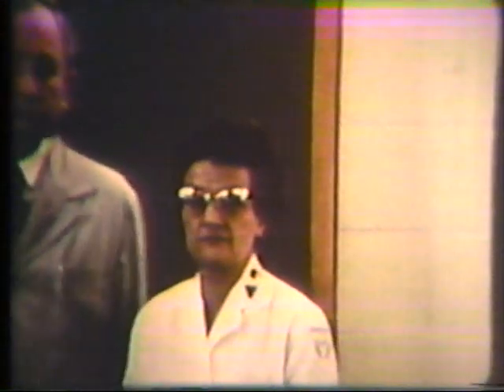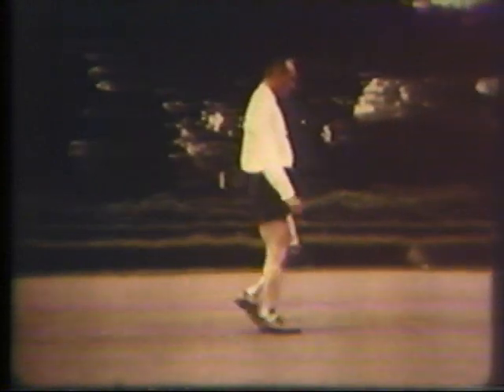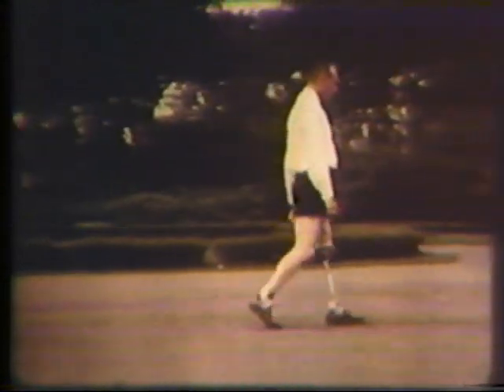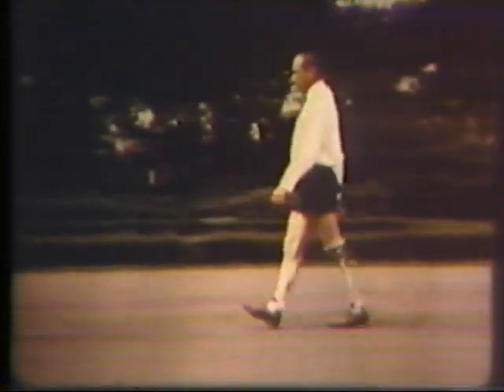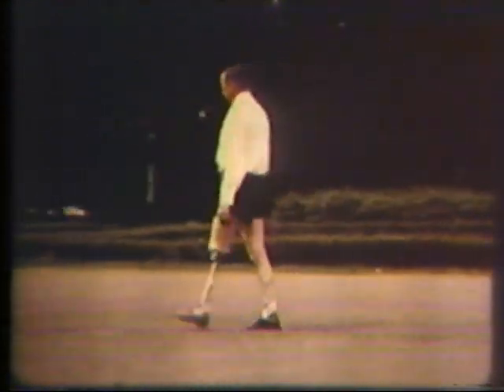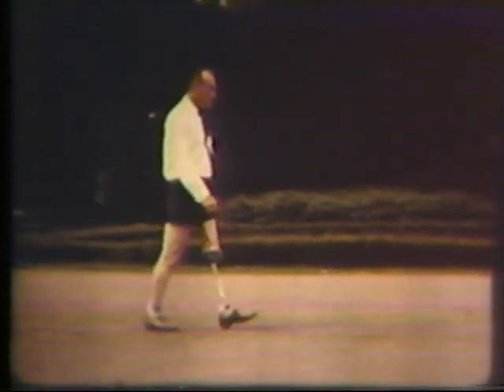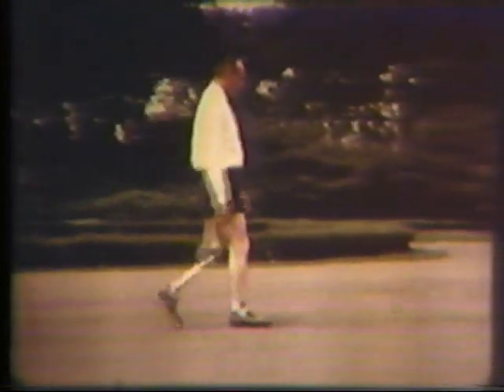Ms. Hildegard Myers, chief of physical therapy of the Rehabilitation Institute of Chicago. We have an above-knee amputee who is a skilled walker, able to handle his prosthesis well under all conditions, and able to simulate many different gait defects seen in an above-knee amputee. His stump is a medium length. As you observe this patient walk, note that the steps are of equal length.